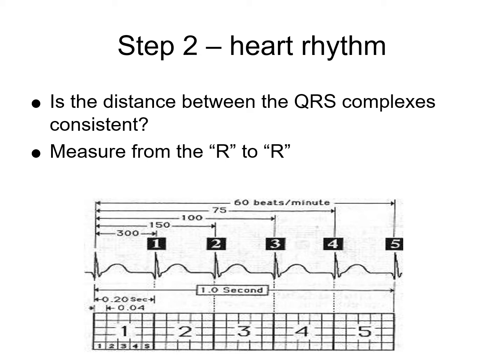Regularly irregular means that the irregular rhythm occurs in a pattern. Whatever it is, it's happening again and again, so rhythms that are irregular in a pattern. Occasionally irregular is when only 1 or 2 R to R intervals are uneven, so it might just be like a little blip.